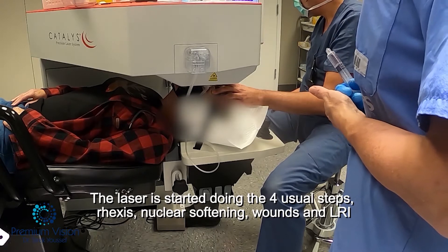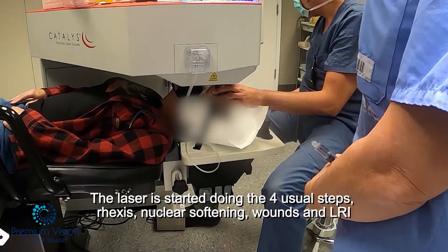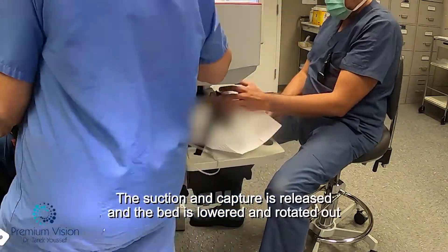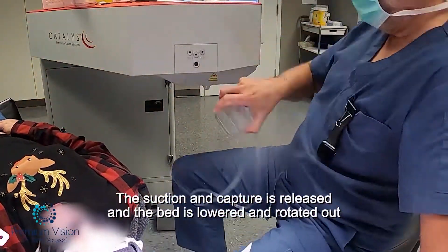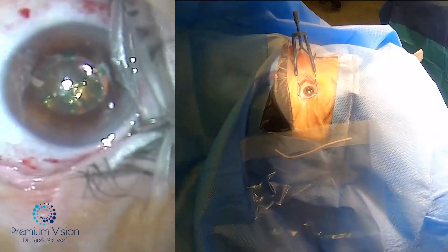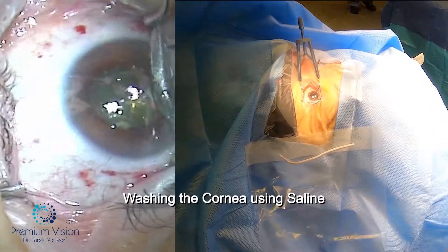The laser will start scanning with OCT the different layers of the eye and then applying the laser itself — the four steps. After we've done the laser, we move the patient out and raise the bed back again to start the cataract.